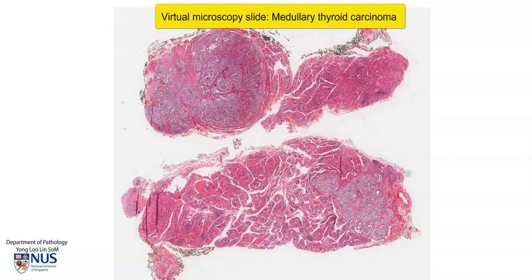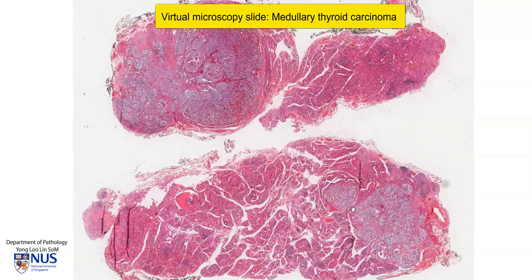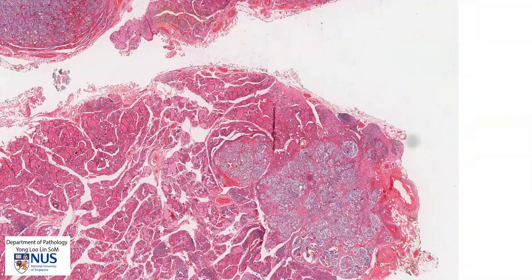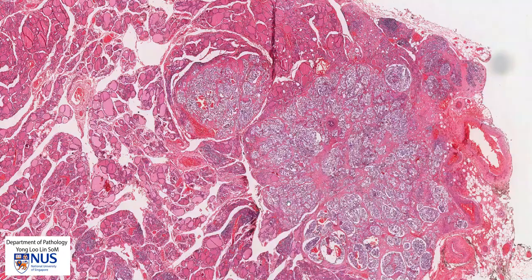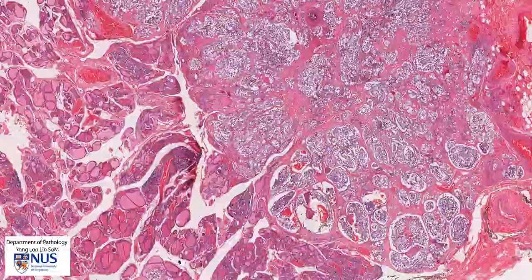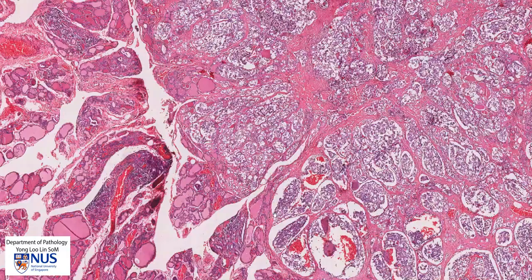The diagnosis is medullary thyroid carcinoma. The tumor itself is a little bit irregular with some areas that appear to be infiltrating into the thyroid parenchyma, as you can see here.